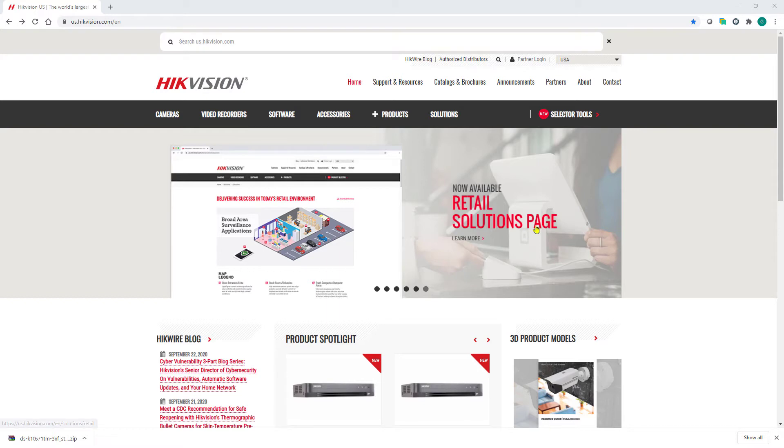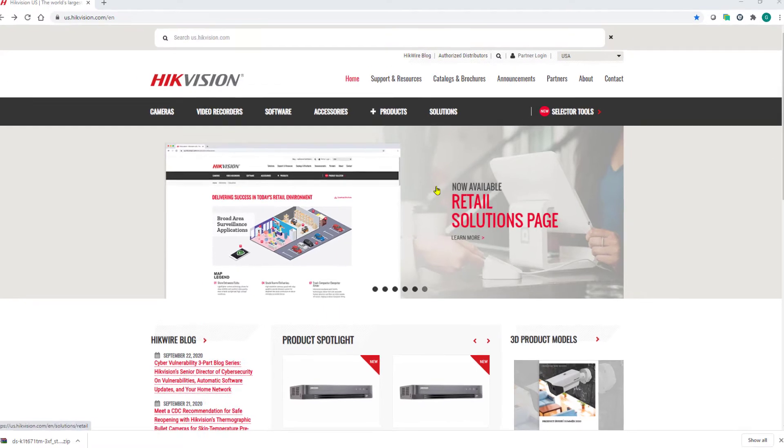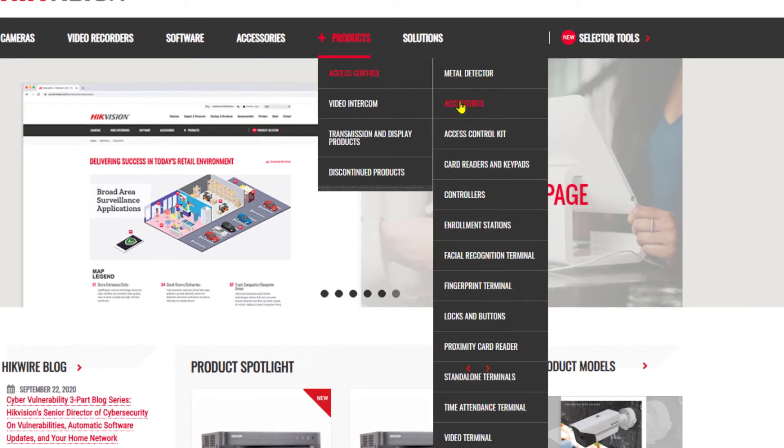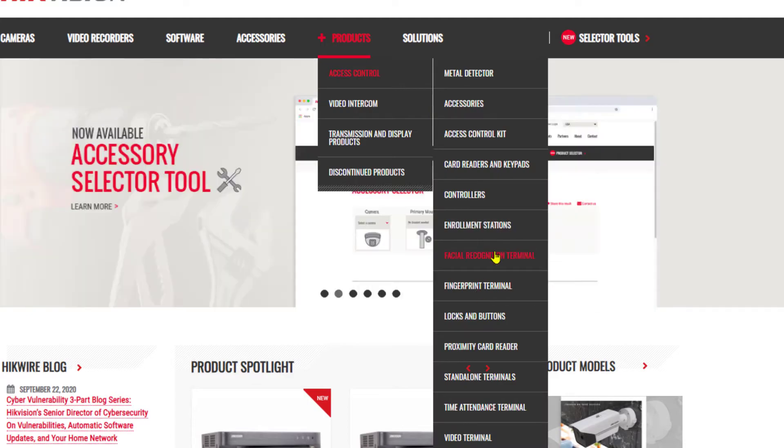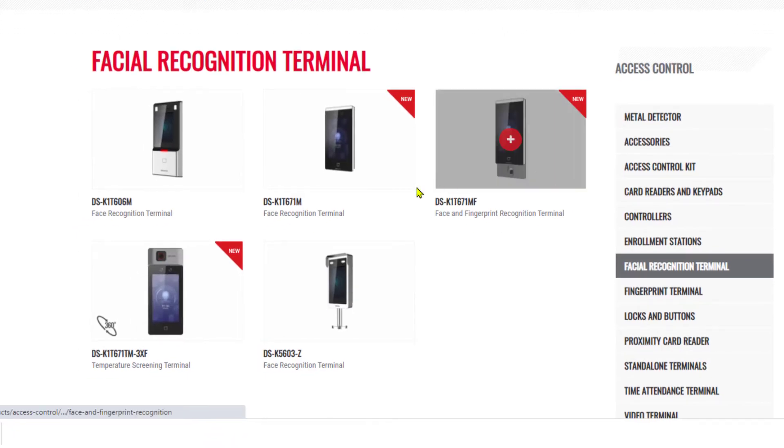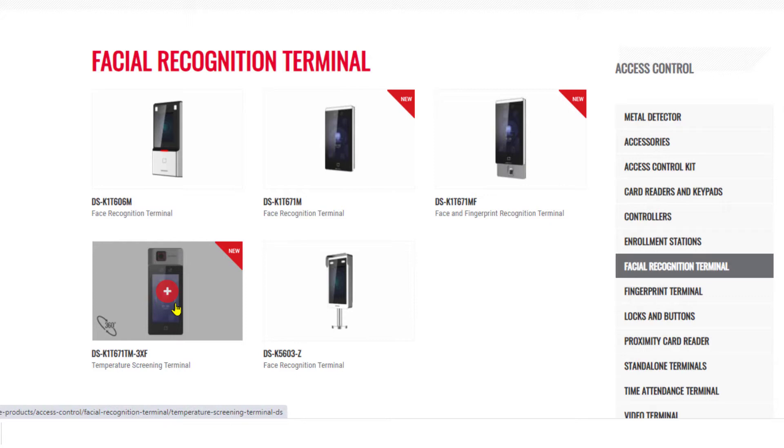We're going to start off by going to the HikeVision website. For the firmware, we're going to go to products, access control, facial recognition terminal, and we're going to look for our temperature screening terminal here in the list.